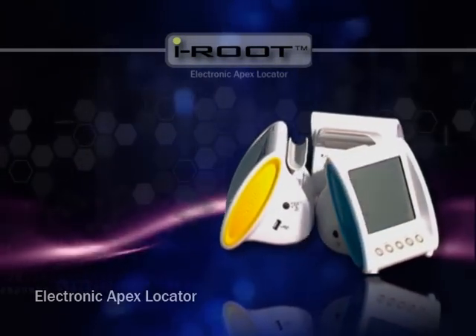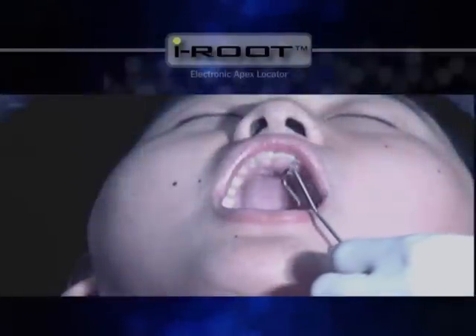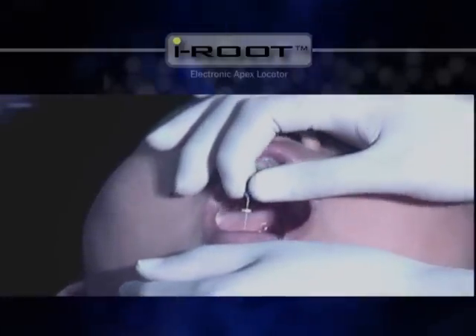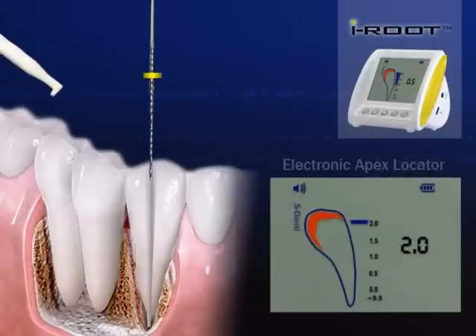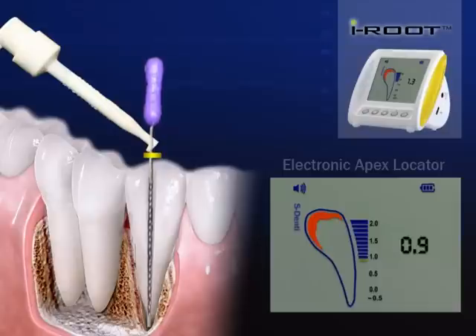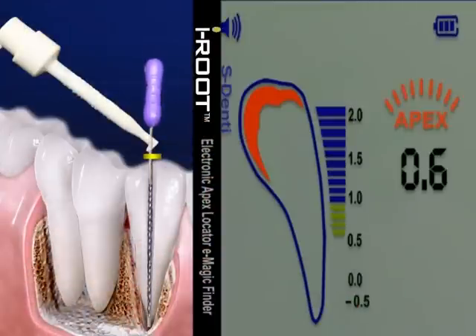Here's how to measure a root canal with iRoot. Turn the power on, hook the lip clip connected to the probe in the corner of the patient's mouth, and have the file ready. Clip the file holder to the file connected to the probe. Insert the file and slowly move it forward while rotating it gently until the meter on the screen shows 0.5. When it reaches 0.5, the word APEX in red letters on the screen flashes and the beep becomes strongest.